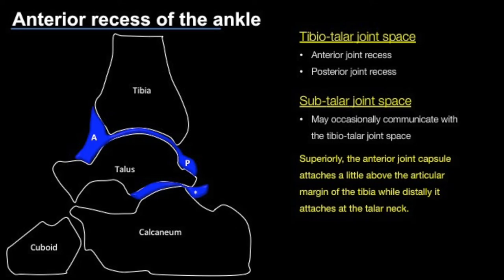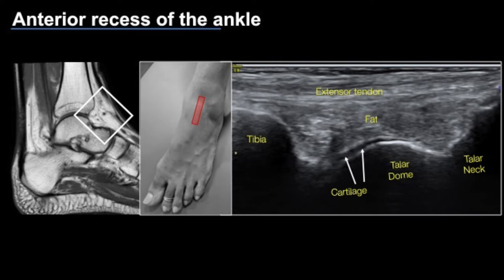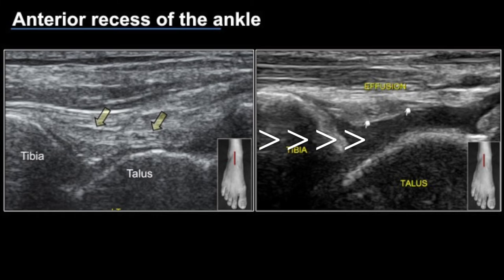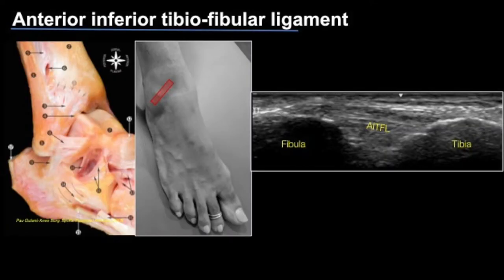We start scanning the anterior joint recess in the long axis by identifying the tibia, the talar dome, and the talar neck. Just above the talar dome we see a hypoechoic cartilage, and just anterior to that is an intra-articular but extra-synovial fat pad. Scanning from medial to lateral, we look for joint effusion. On the left side is the normal ankle joint showing the tibia, talus, and anterior fat pad, while on the right side the effusion has displaced the anterior fat pad anteriorly.